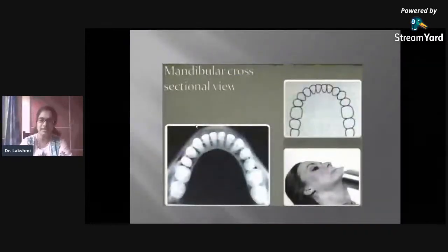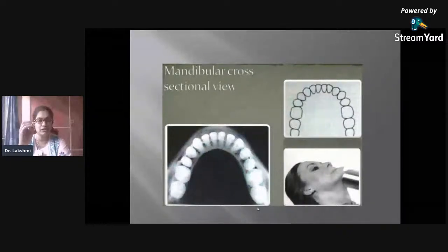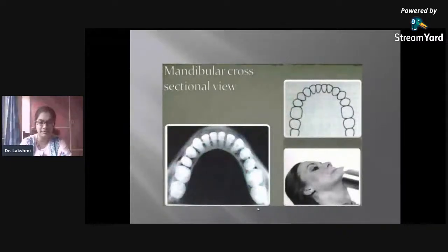Okay, can you see it is a little bit below the chin, not at the tip of the chin. From here, the central ray enters. So this is positioned farther backward than the topographic position, wherein you can see even the molars, okay? The entire dentition is visible. And this is the place where it is the soft tissue. So in case there are any salivary stones in the Wharton's duct, of the submandibular salivary gland, they can be visible in such radiographs, okay?